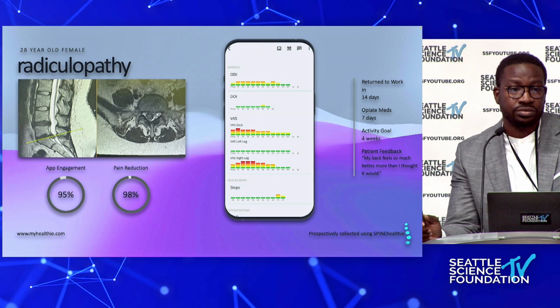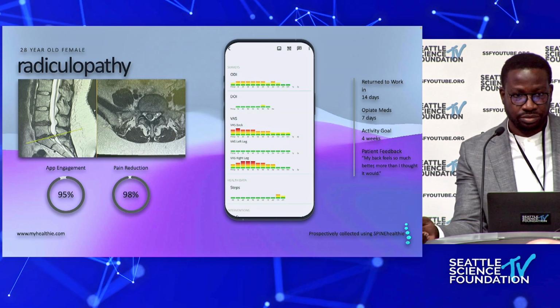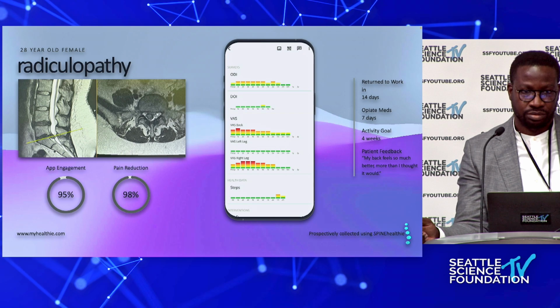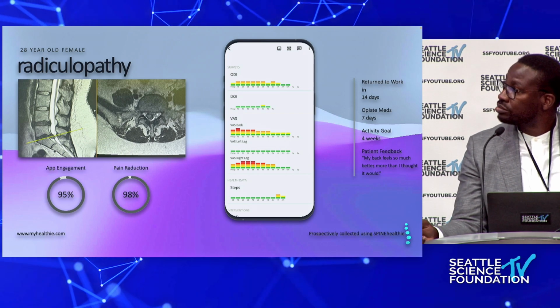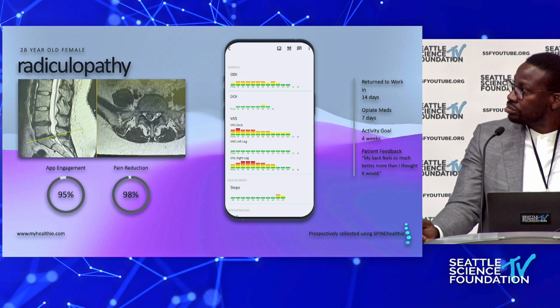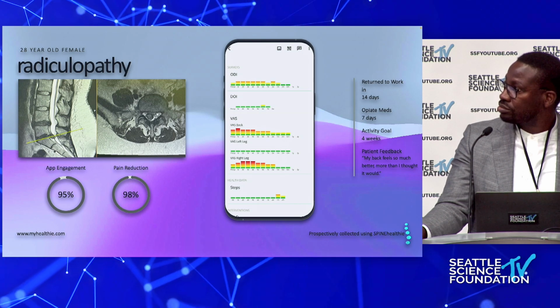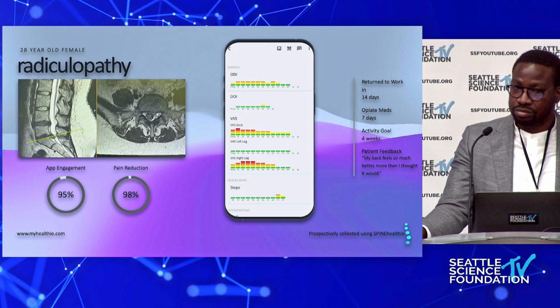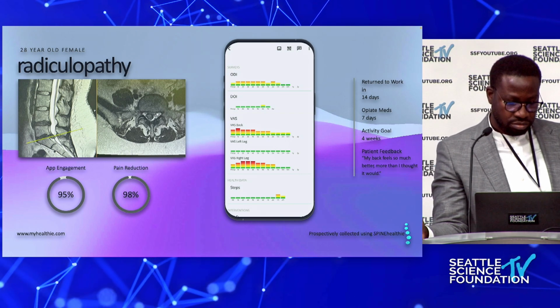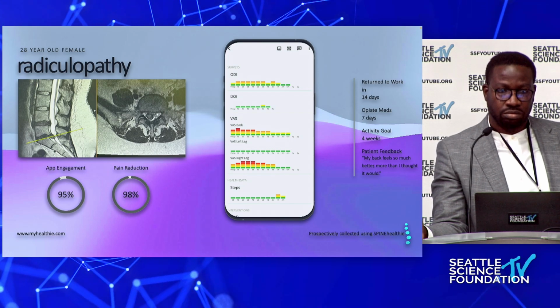John, I think one of the benefits of endoscopy, and especially the interlaminar approach here, is how easy it is to work in the axilla between the thecal sac and the traversing nerve root. These kinds of cases in particular are particularly amenable to that, because you can see that traversing nerve root really being plastered laterally. And in these, I typically plan to work primarily through the axilla, at least to debulk that until you can mobilize the traversing nerve root and get it over, which is not something I would feel comfortable doing through a tube or open or anything like that.